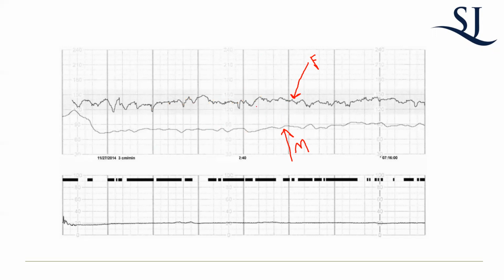Sometimes you'll have interesting situations where the fetal heart rate baseline range, which we'll get into, has its lower end at 110 beats per minute. Sometimes you have a mom who's tachycardic to like the 110s, and sometimes that's their baseline. So you'll have the lines be really close together. You have to be pretty careful, because if you have fetal bradycardia, is that mom or is that baby, right? That's why it's good to have both of these and have a good understanding of what your baseline is, okay?